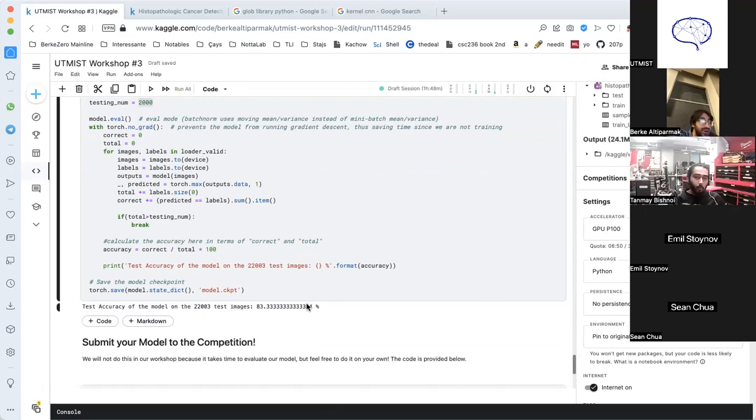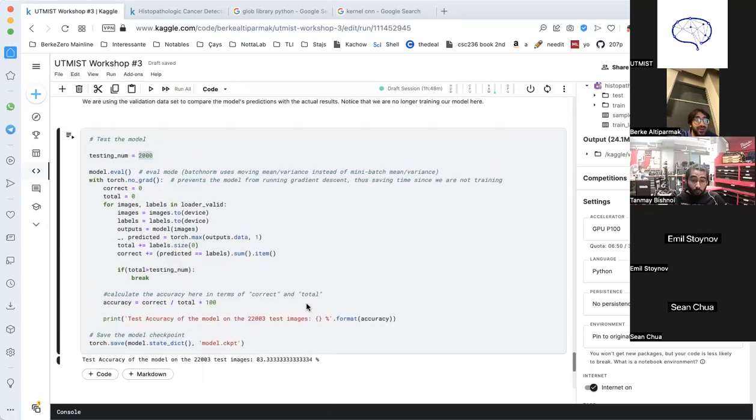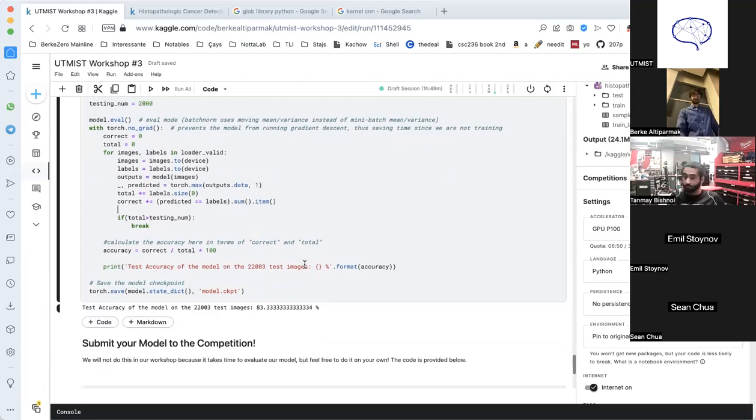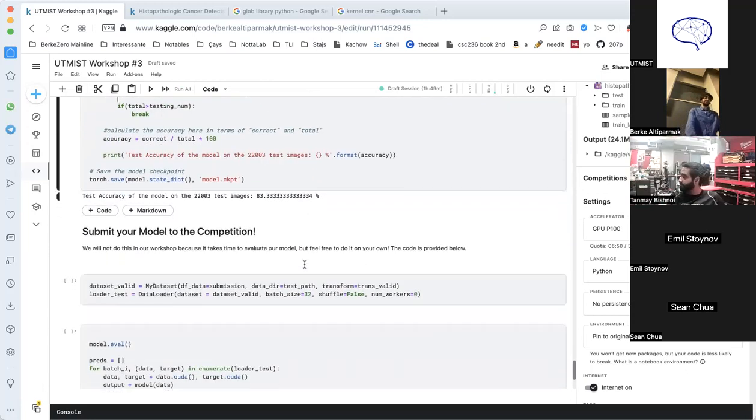We worked on less than 2% of the data, I think 0.5%, to work faster. If we work on the whole data, our model has the capability to reach 95% accuracy. We just reached this with five minutes of training.